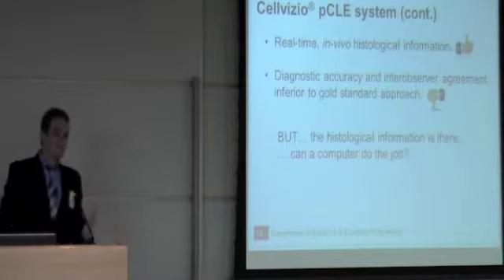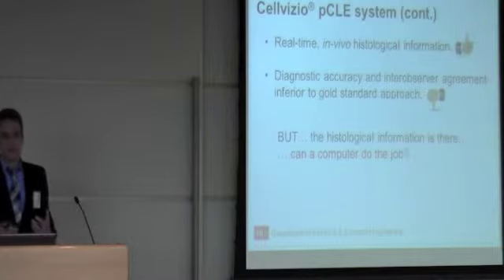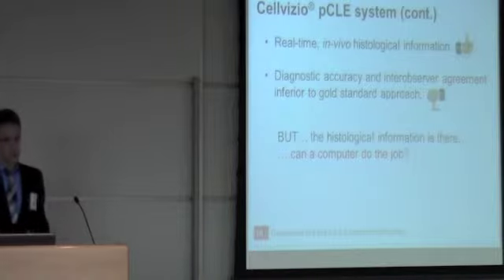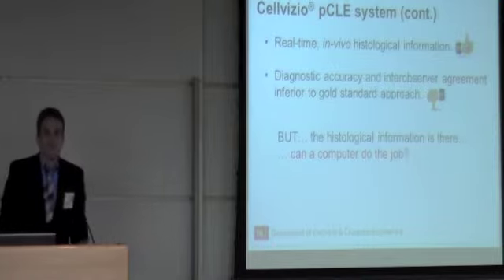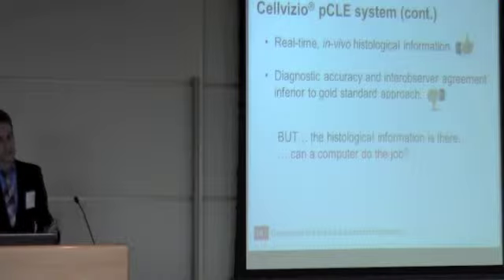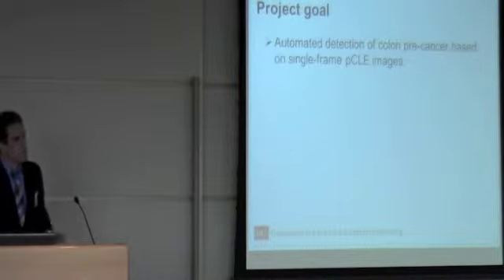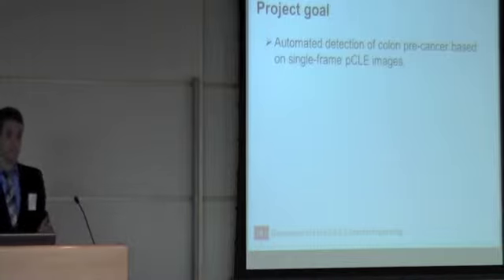However, clinical studies show that the diagnostic accuracy and inter-observer agreement between human interpreters is in fact inferior to the gold standard. But again, the histological information seems to be there. So if humans cannot do the job, can a computer do the job? That's where my project comes in. The aim of my project is to develop a method that can detect colon precancer automatically based on single-frame PCLE images.